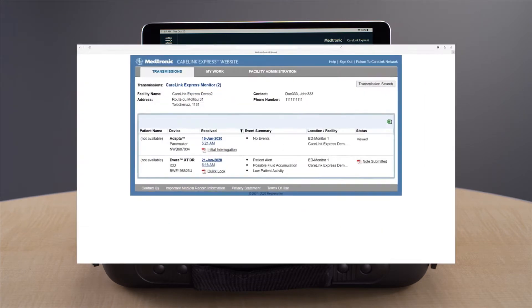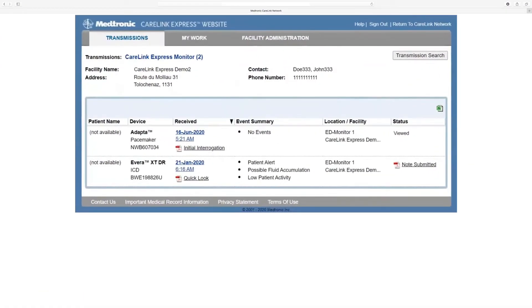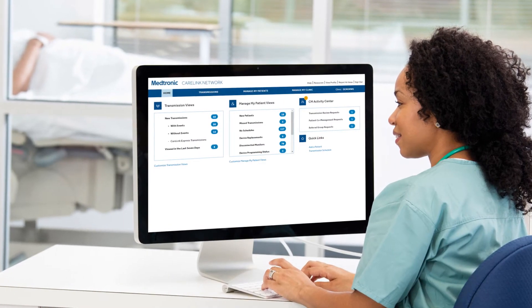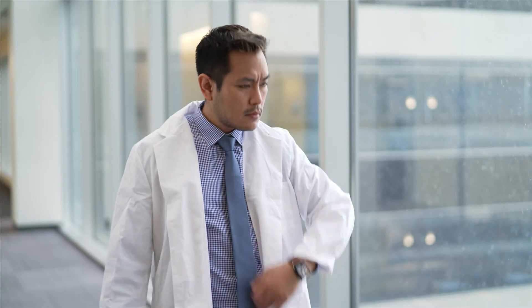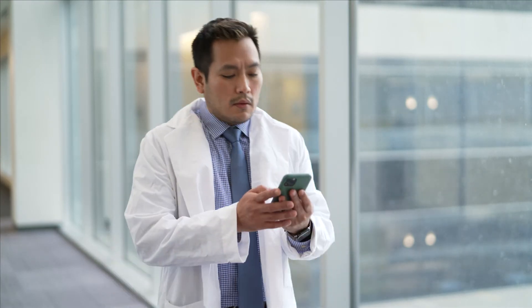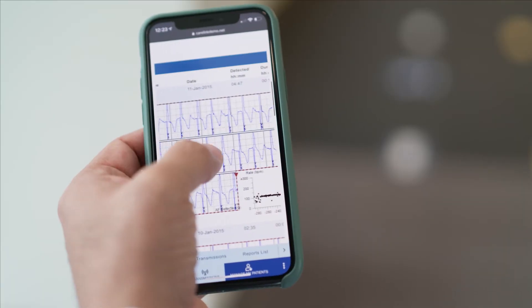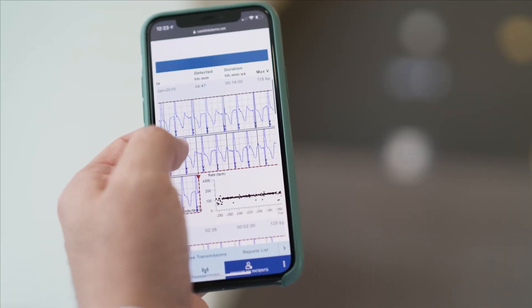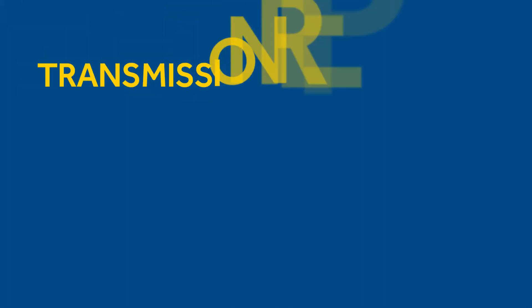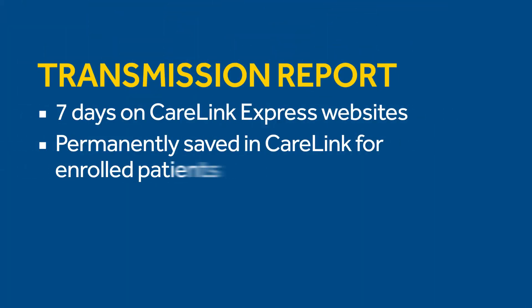The app automatically transmits the data from the implanted device to the Medtronic CareLink Express website and the CareLink network. The device expert will receive an email notification that a CareLink Express transmission is available. The interrogation report can be sent via fax or secure email. The data can be viewed on the CareLink Express website for seven days.